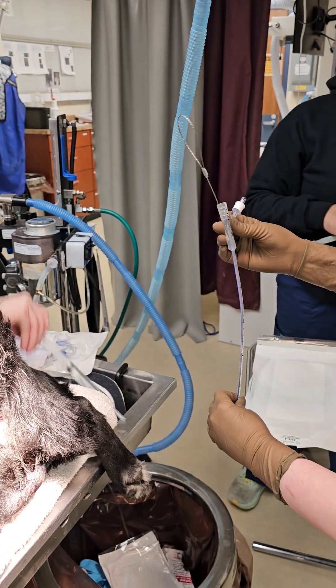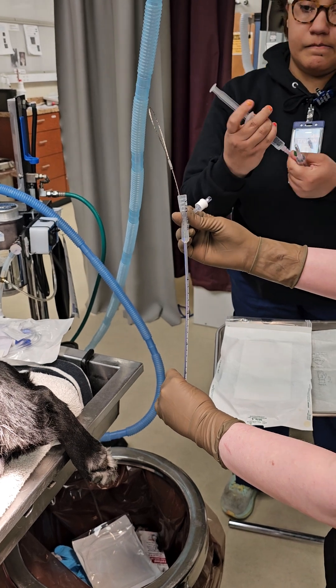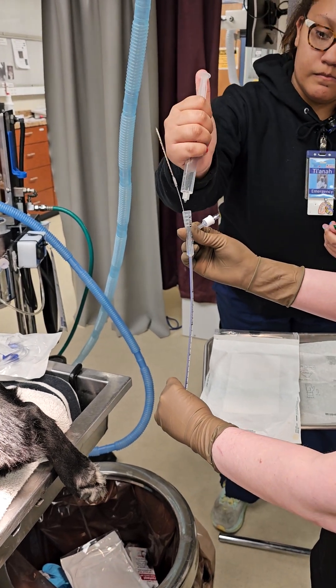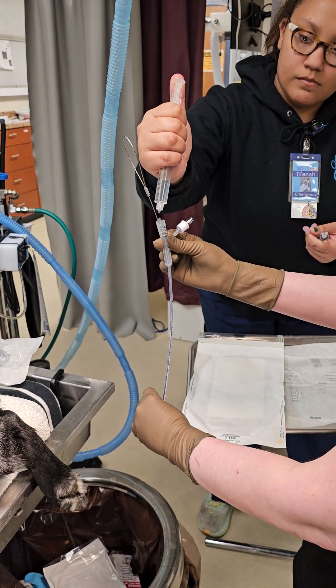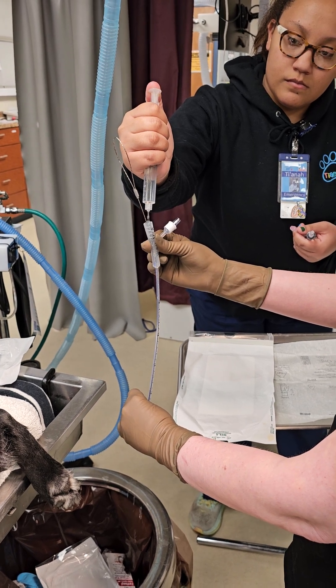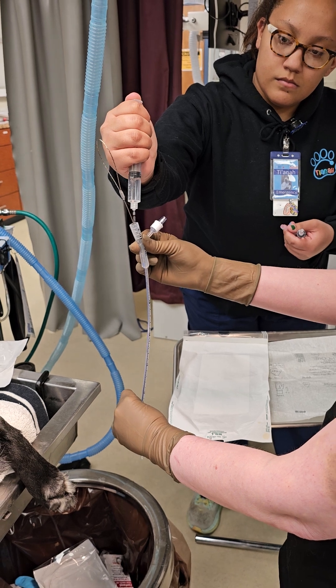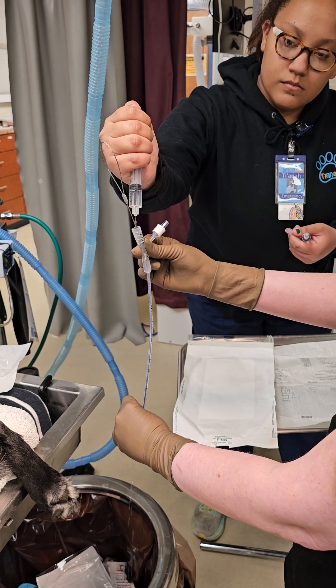First, dribble in the saline — dribble all of it in. That's going to help activate the lubrication on the inside of the urinary catheter. This is especially important if you're doing it in anything 8 French or smaller.